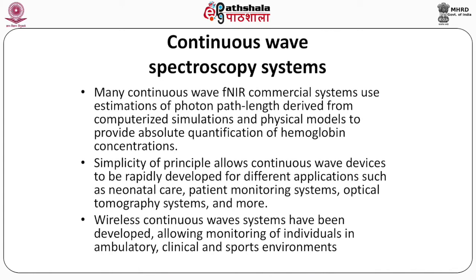Continuing with the continuous wave spectroscopy system, many continuous wave fNIRS commercial systems use estimation of photon path length derived from computerized simulation. They use computer-based simulation models and physical models to provide the absolute quantification of hemoglobin concentration. Simplicity of principle allows continuous wave devices to be rapidly developed for different applications such as neonatal care, patient monitoring systems, optical tomography systems, and many more.